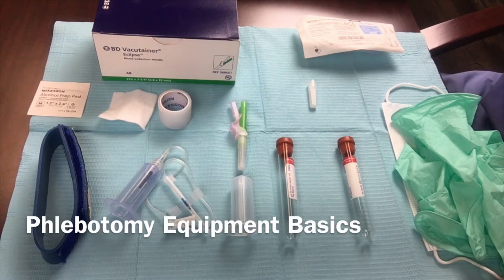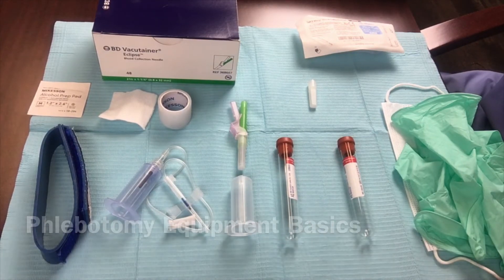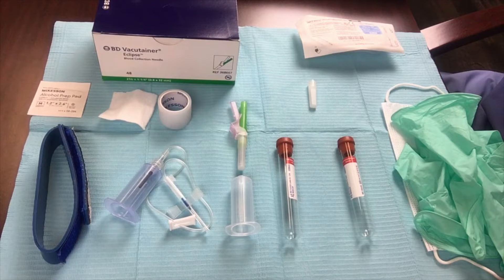I want to go over some basic phlebotomy equipment. This is the stuff that you will need in your office to do blood draws for your patients in order to process the blood products for platelet-rich fibrin. Very basic equipment, but I thought it was worthwhile to go over it.